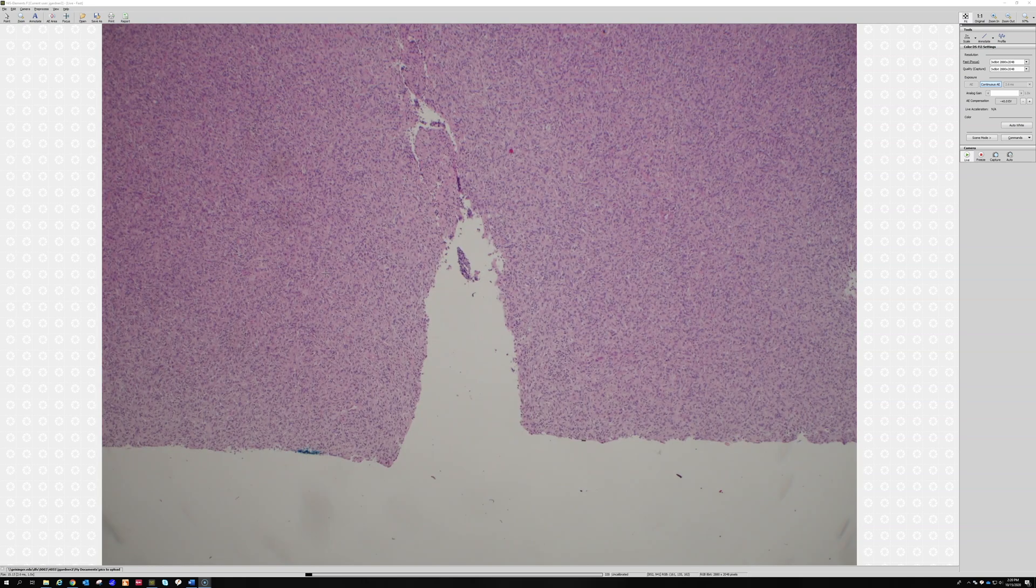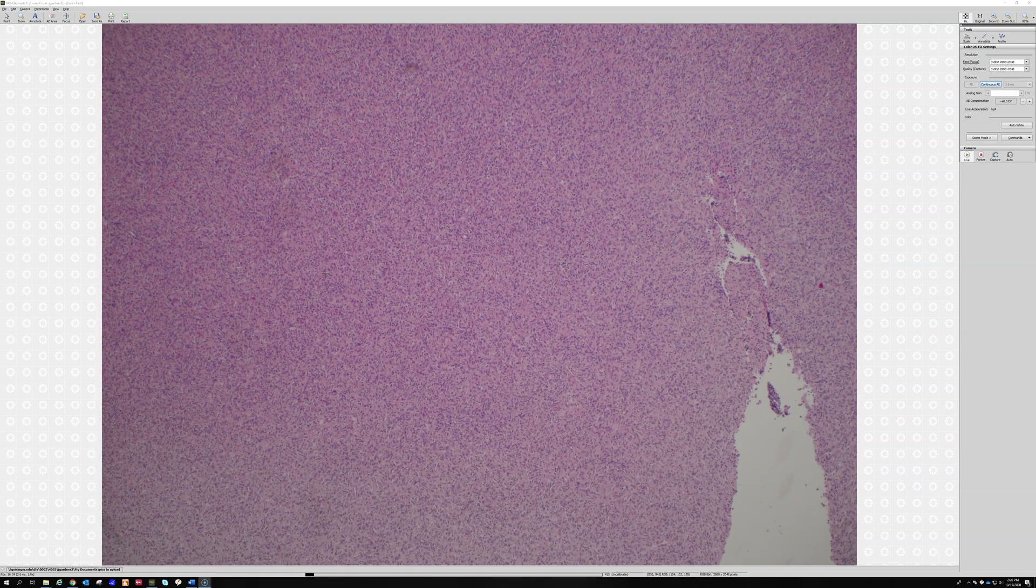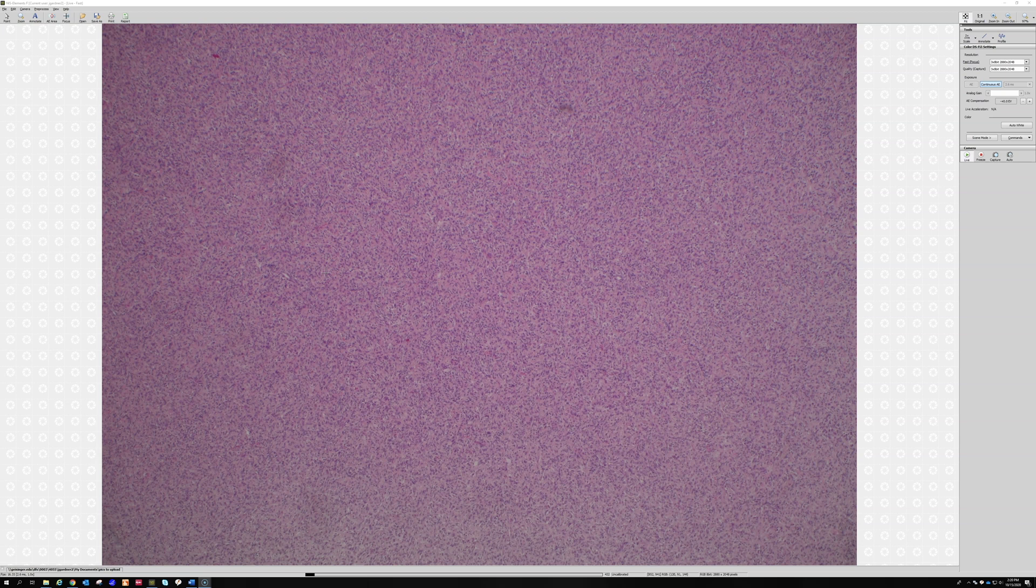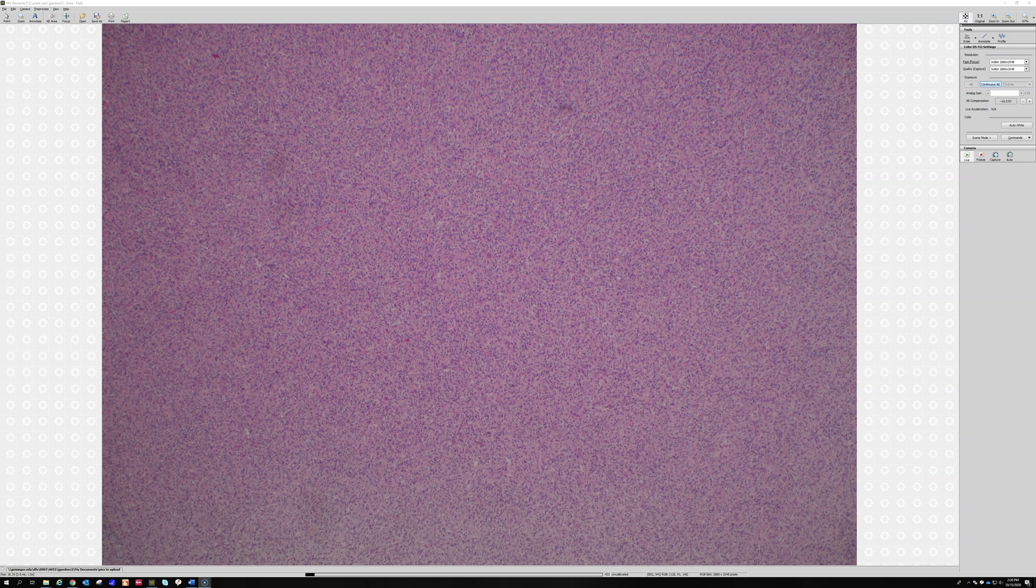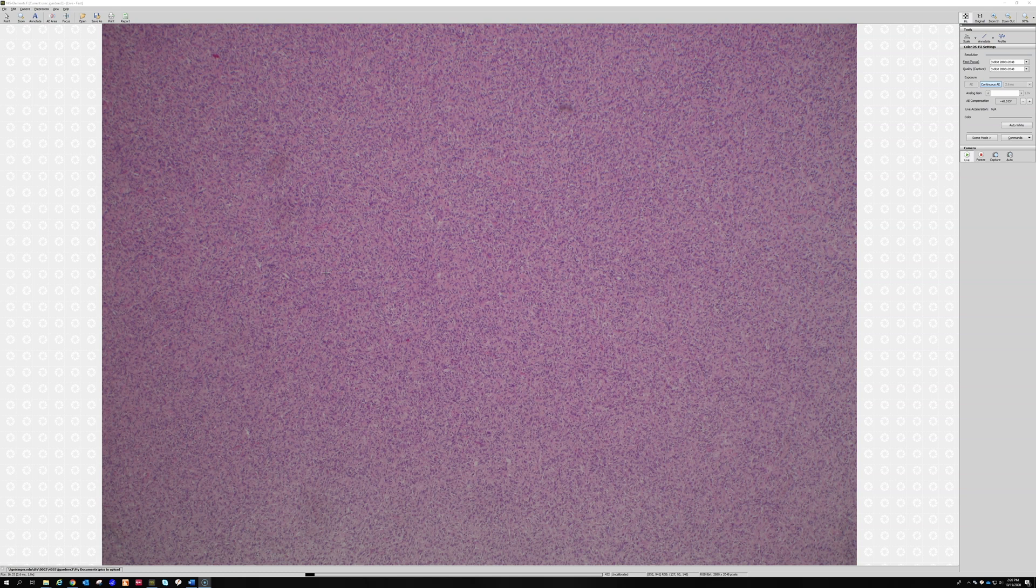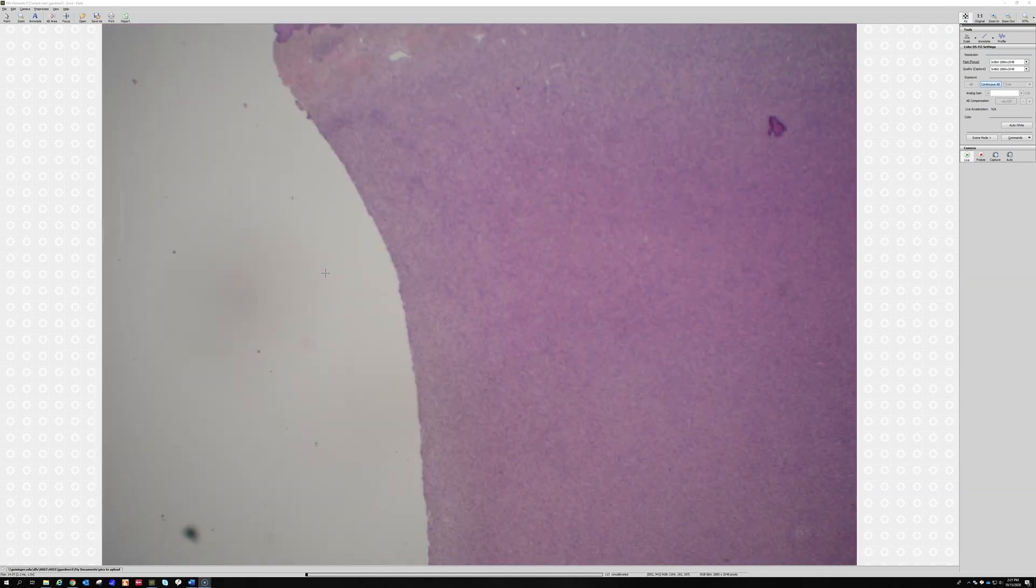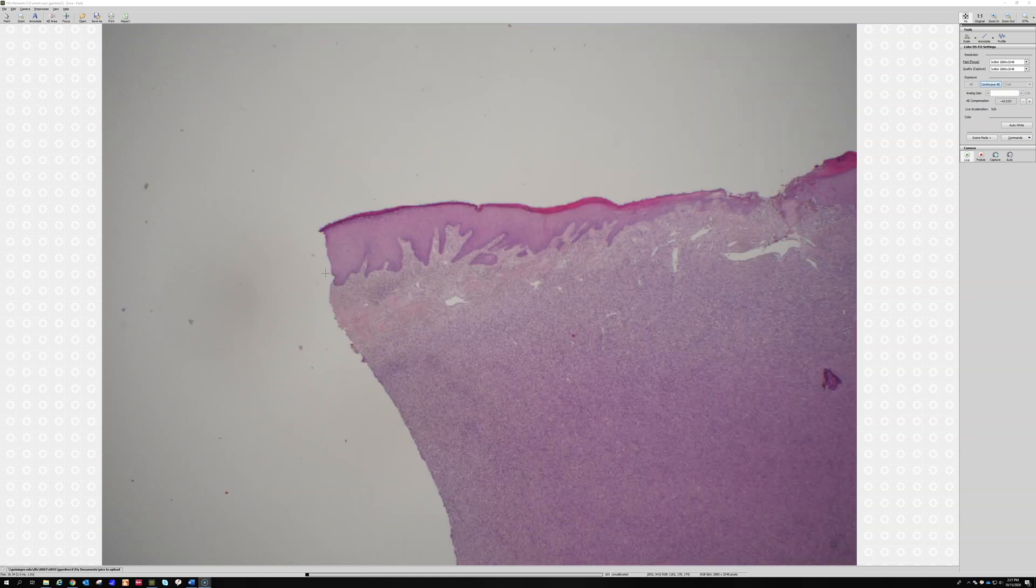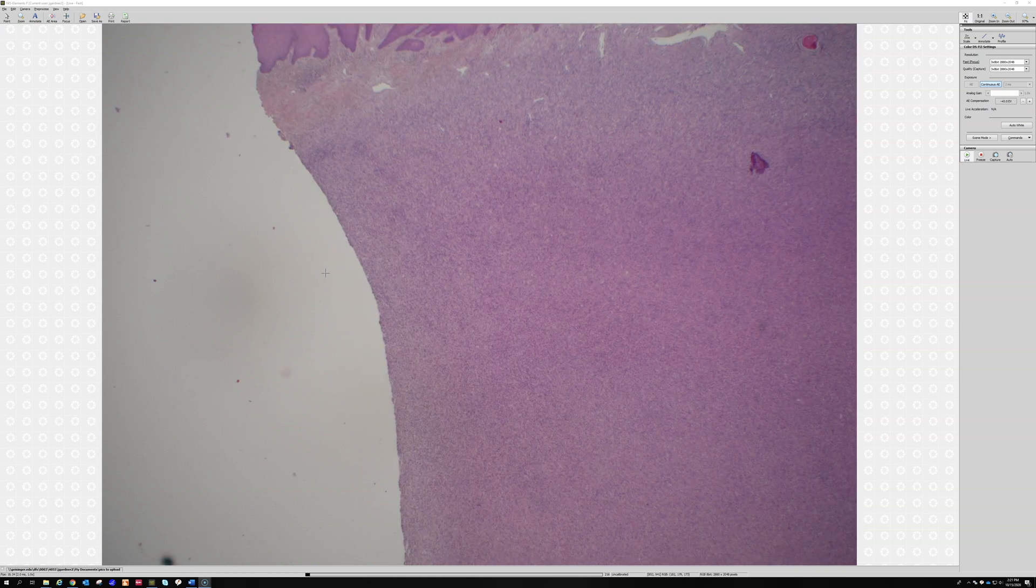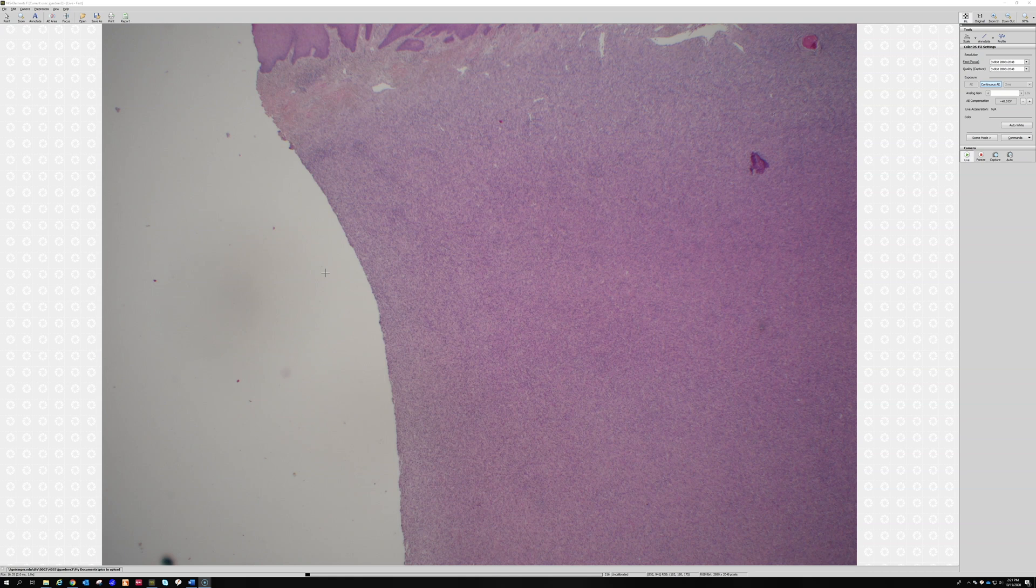I think sometimes people will get worried about this being a DFSP just because it's so big. But I would say also that a lot of times the clues that we use for diagnosing dermatofibroma and DFSP are not just the cells but what they do at the periphery. Seeing how it interfaces with the collagen or the fat or the epidermis are all helpful things. When those clues are taken away from you, like when someone puts a punch biopsy in the middle of a big lesion, but in this case even though we have a huge section, the lesion was just so big that we couldn't really see what was happening at the periphery.